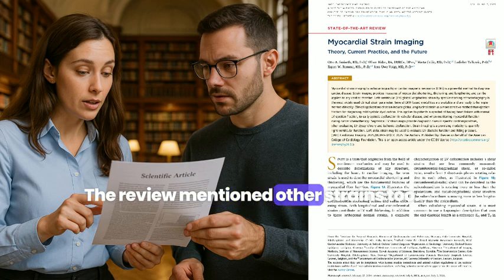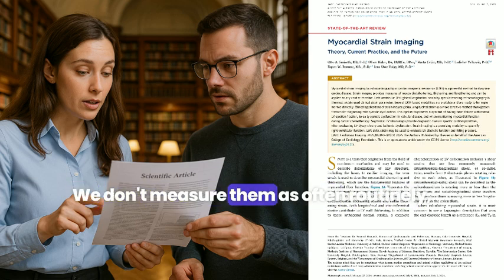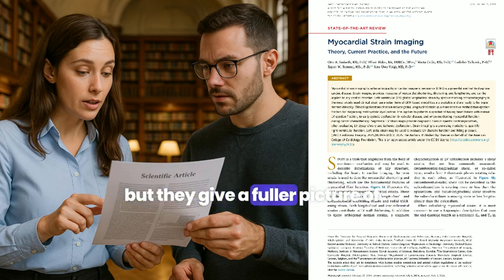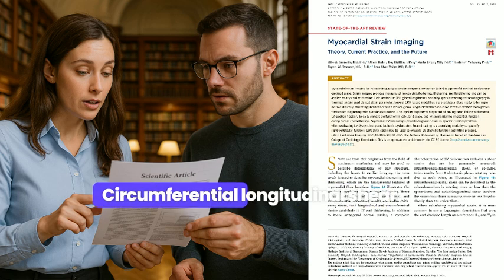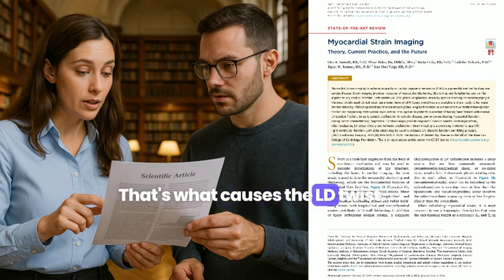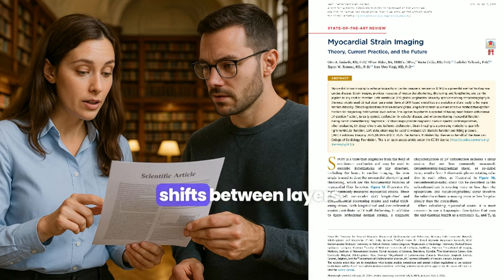The review mentioned other strains, too, less common ones. Yeah, shear strains. We don't measure them as often routinely, but they give a fuller picture of the heart's complex 3D motion. Like the twist? Precisely. Circumferential longitudinal shear, that's what causes the LV twist. Yeah. Then there are others. Circumferential radial, radial longitudinal. They describe more subtle shifts between layers.